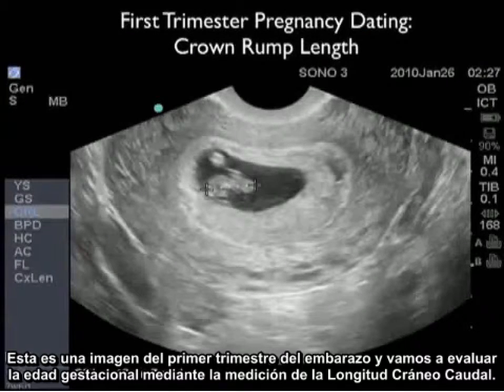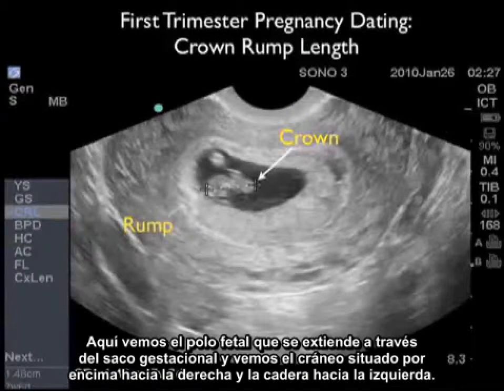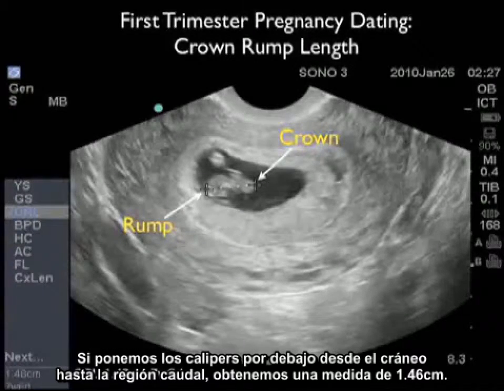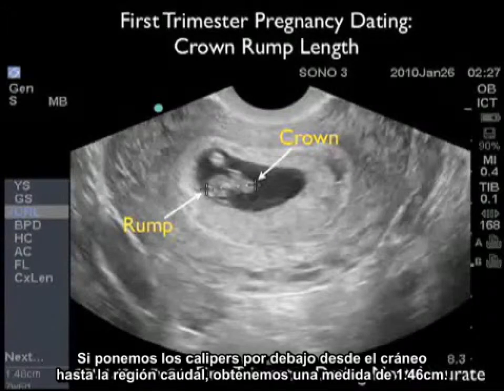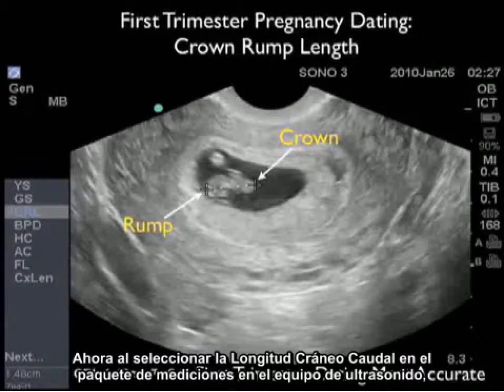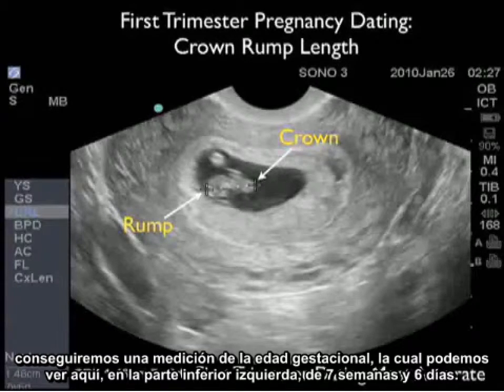This is an image of a first trimester pregnancy, and we're going to evaluate the gestational age by measuring the crown rump length. Here we see the fetal pole stretched across the gestational sac, with the crown located towards the right and the rump towards the left. Placing calipers from crown to rump, we get a measurement of 1.46 centimeters. By selecting crown rump length in the software package on the ultrasound machine, we get an assessment of gestational age shown towards the bottom left.